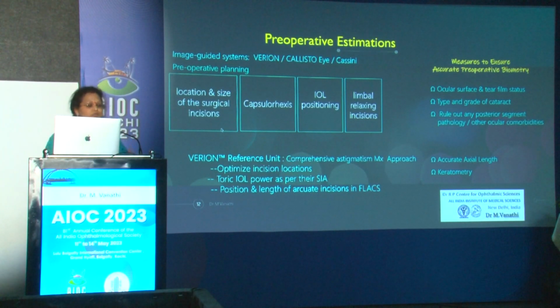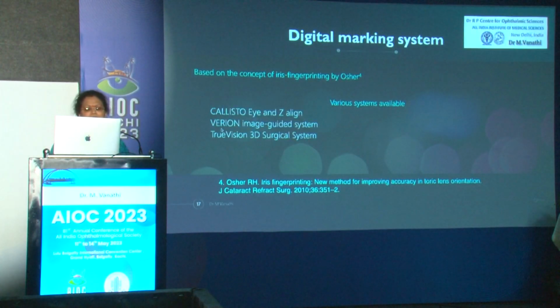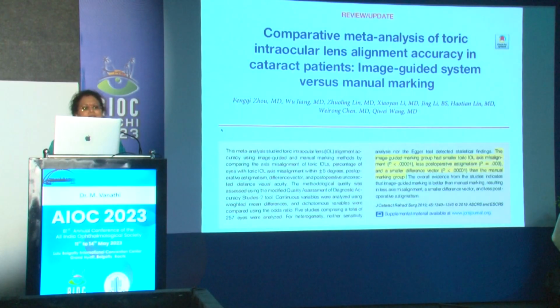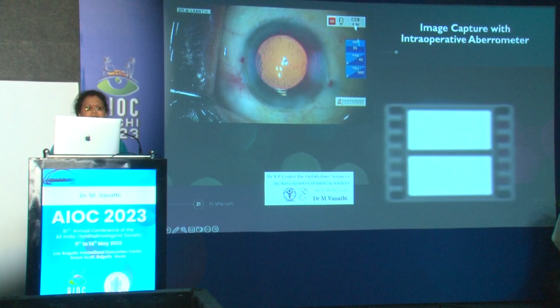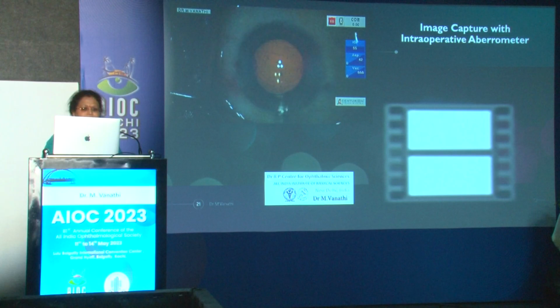And when you do use femtosecond laser assisted surgery, you can probably add on limbal relaxing incisions and change your IOLs to monofocal IOLs here. But when I do trifocal torics, I would not prefer to place limbal relaxing incisions in these patients. Again, there's a lot of literature comparing the various marking systems here. But the slit lamp marking system also works fantastically well in comparison to the other pendular or other types of markers.